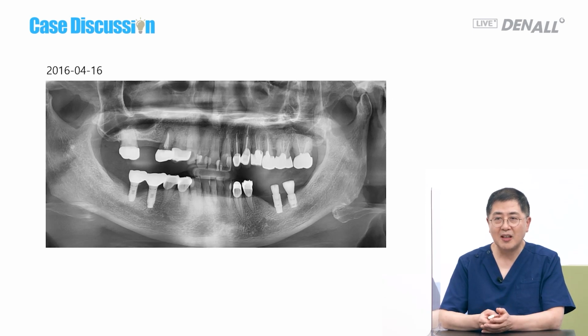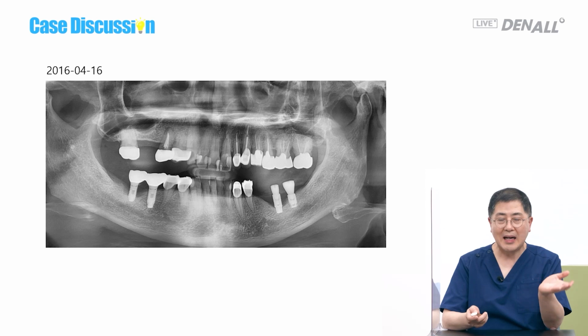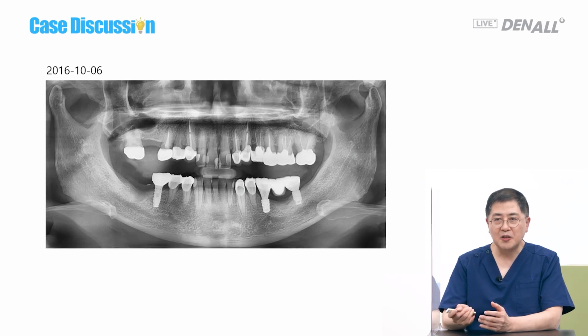I thought if occlusal load is reduced, the bone can be formed, but it was not the case. During the waiting period, on the other side, the bone resorbed, therefore both of them were explanted and a bridge was used there. So natural healing capacity is really marvelous. But during the discussion today, I realized that I missed socket preservation, and I am thinking about doing it in the future.